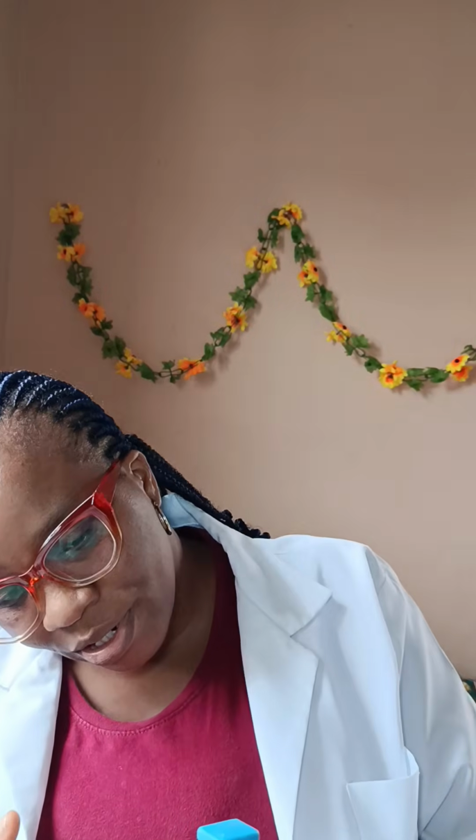Two, the urinometer should not touch the walls of the measuring cylinder that contains the urine. And you don't read like this. Let's assume this is my eye level. I read it this way, or you can bend so that you'll be at the same level, or you can raise it up and read at eye level. And remove air bubbles if present.